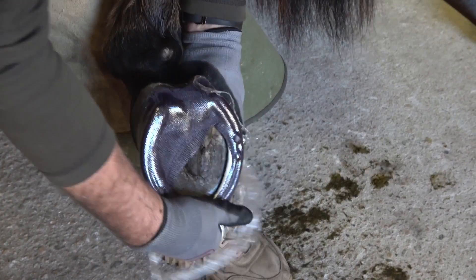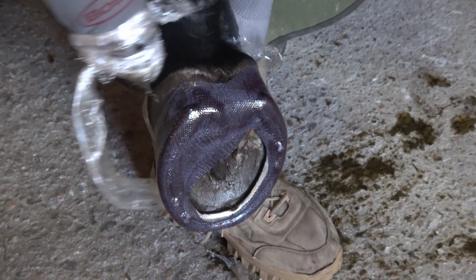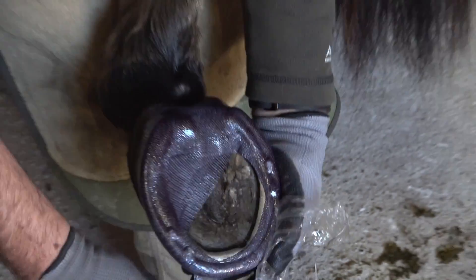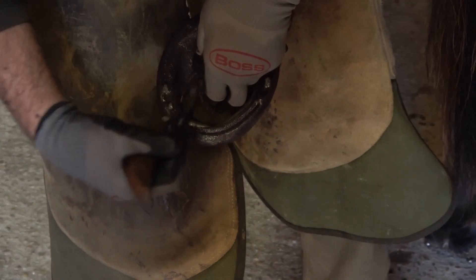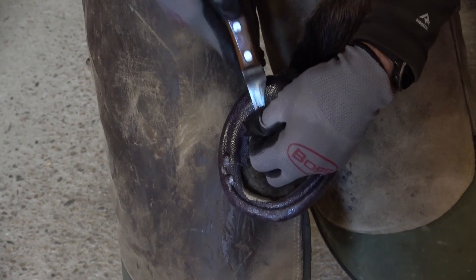Once the cast has mostly cured, you can remove the plastic wrap. If during the casting process your cast covered any areas you do not want covered, it can easily be trimmed at this point before the cast fully cures.